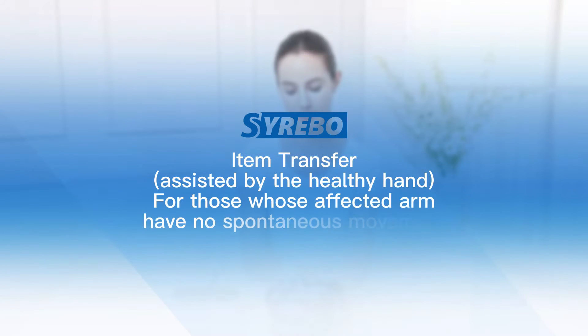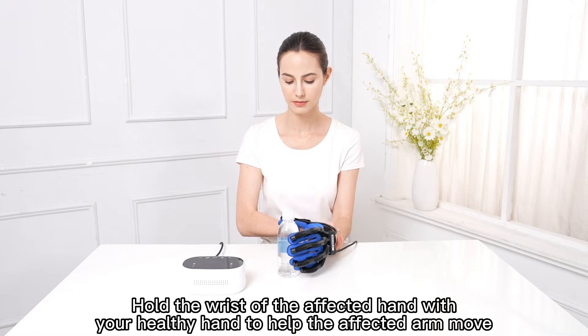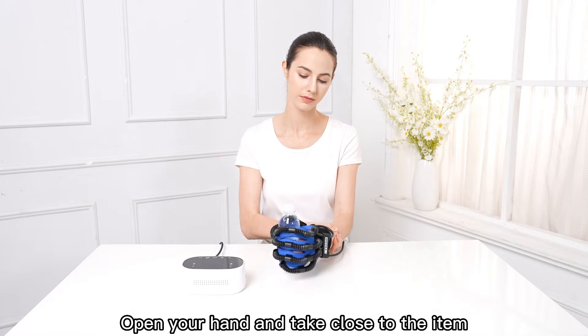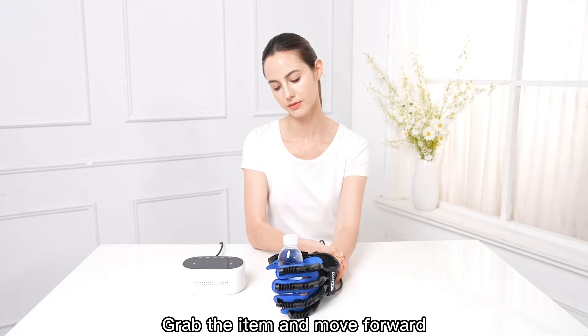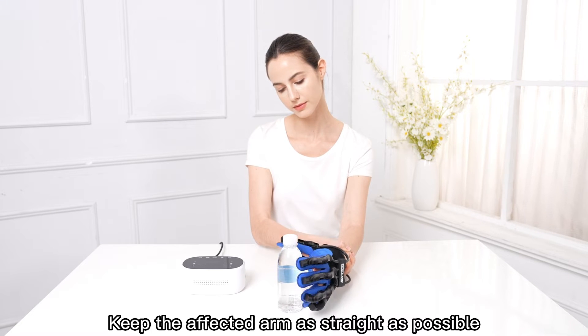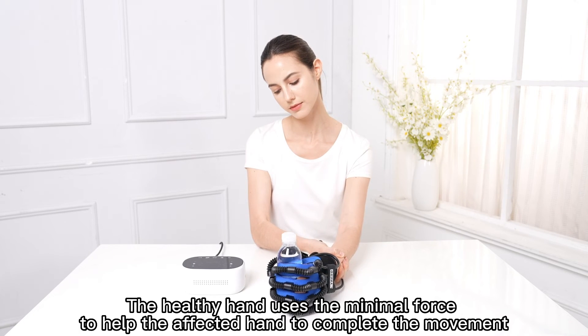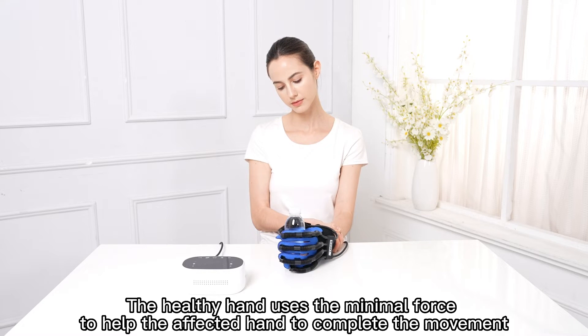Item Transfer — Assisted by the Healthy Hand. For those whose affected arm has no spontaneous movement. Hold the wrist of the affected hand with your healthy hand to help the affected arm move. Open your hand and take it close to the item. Grab the item and move forward. Open your hand and put down the item. Keep the affected arm as straight as possible. The healthy hand uses minimal force to help the affected hand complete the movement.